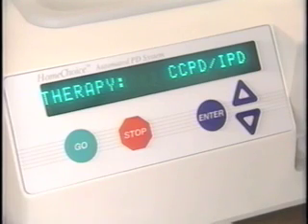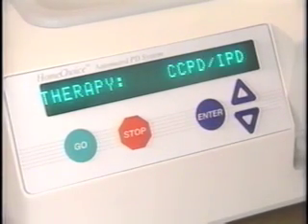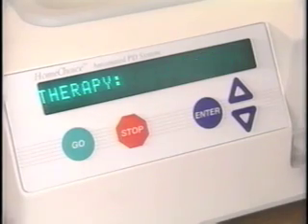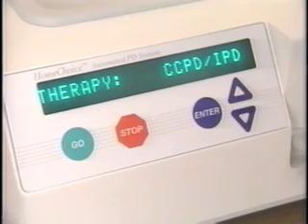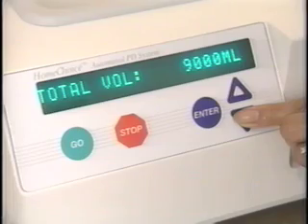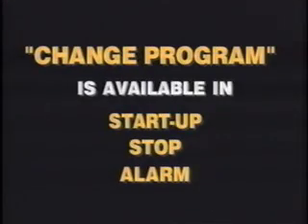For each parameter in Change Program, press Enter to select that option and the display will start blinking. To change the value, use the up and down arrows. Press Enter to save the change. When the parameter stops blinking, press the down arrow to select the next one. If you do not want to change a value, just press the down arrow to move to the next option. The Change Program feature is available in the Startup, Stop, or Alarm menus.